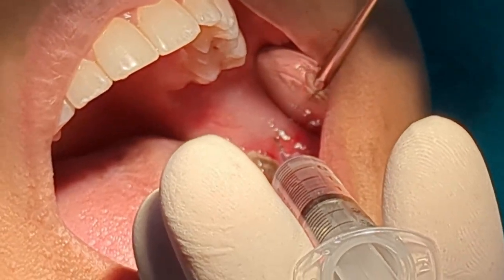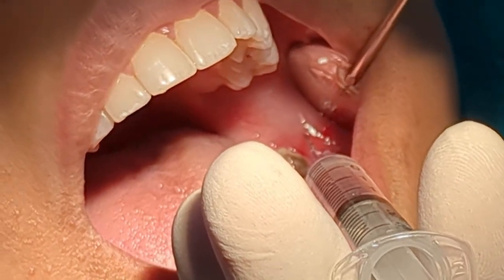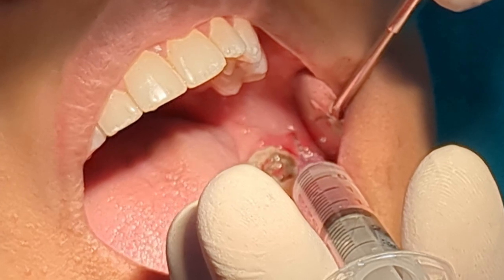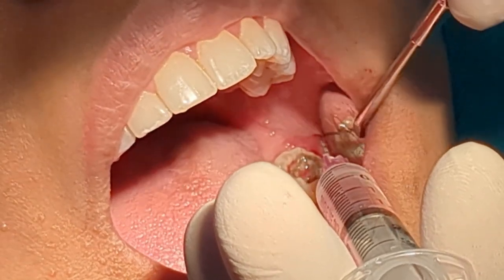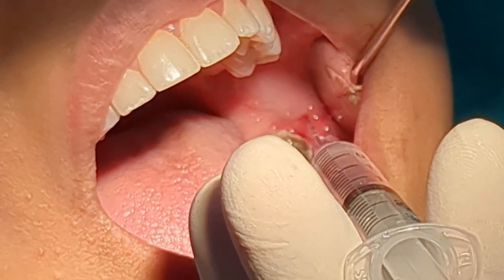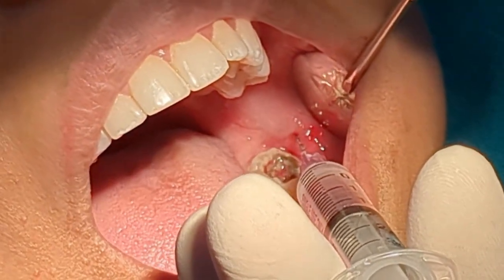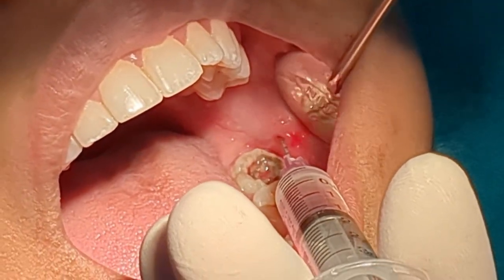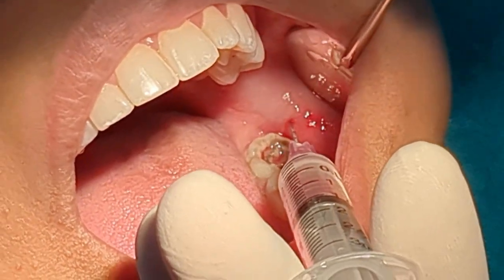For such blocks, I give 0.1 ml initially and wait for a few seconds. I let the 0.1 ml of local anesthetic work, and then I deposit the rest of the LA so that the patient doesn't feel any discomfort while depositing. So I have now deposited the LA here.